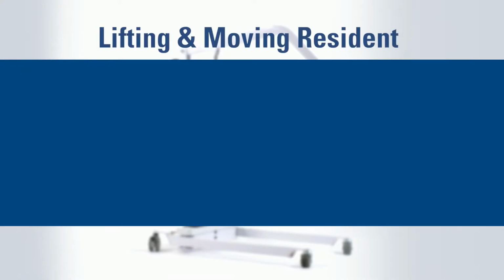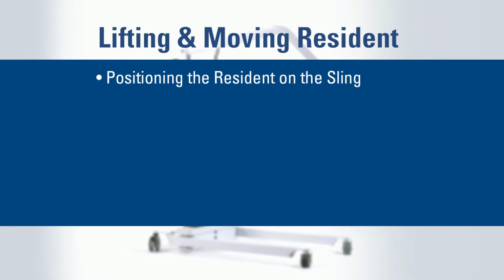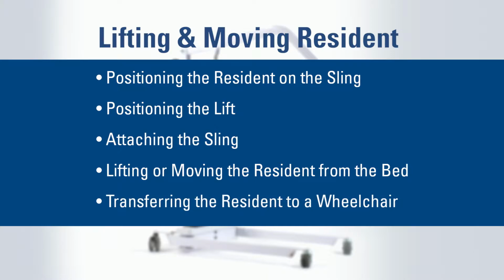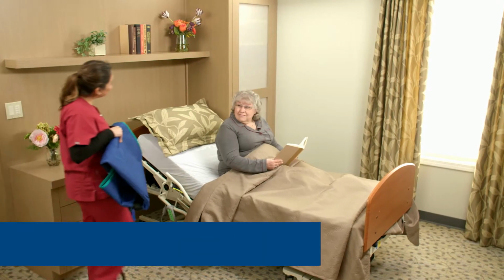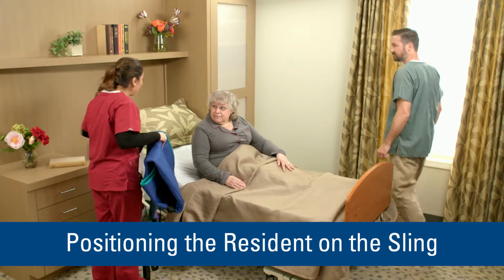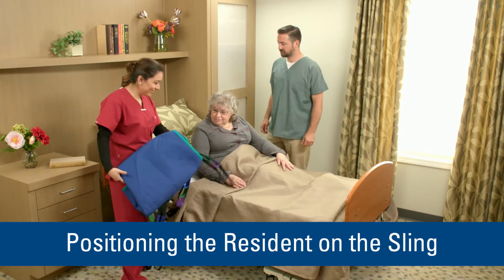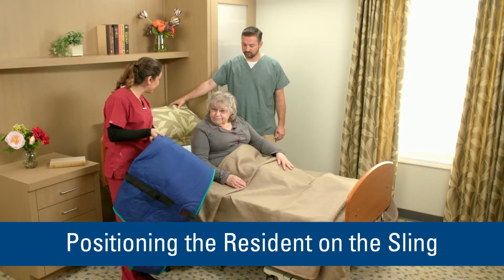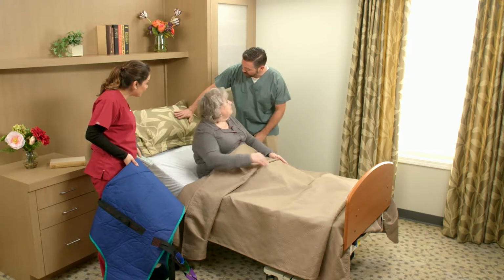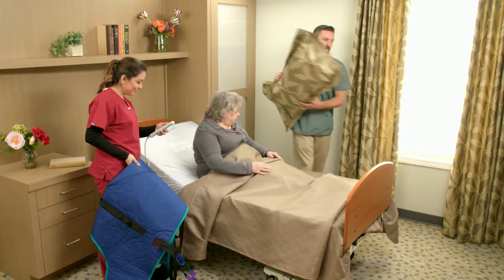We will now go through the process of lifting a resident using 5 steps: positioning the resident on the sling, positioning the lift, attaching the sling, lifting or moving the resident from the bed, transferring the resident to a wheelchair. It is generally recommended that 2 assistants be used when positioning a resident on a sling. The methods shown in this video may not be appropriate for all residents, so be sure to always follow your community's requirements for safe lifting procedures and refer to the owner's manual for complete instructions and warnings.